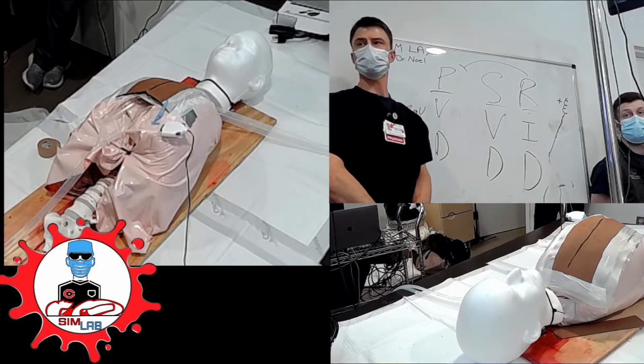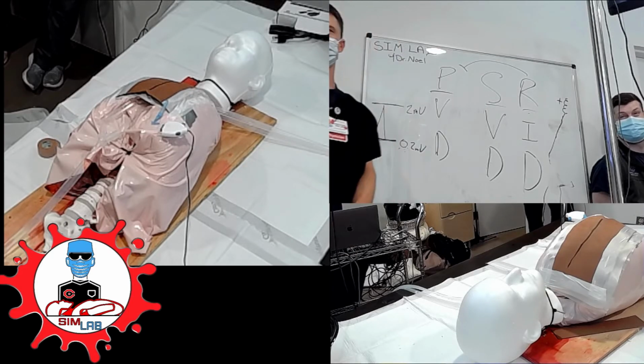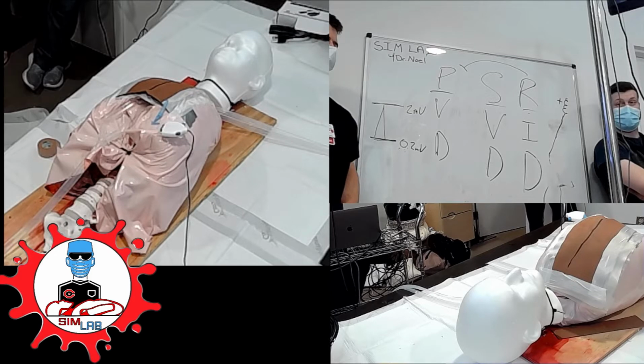Sometimes you can just bury it, and depending on how bad the conduction delay is, if you bury it in the atrium and jack up the milliamps, sometimes you can get conduction. So you do what you can.